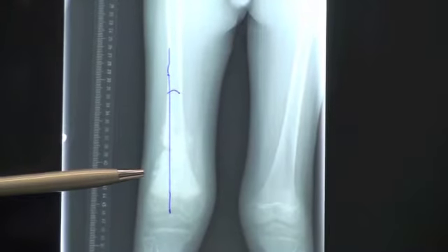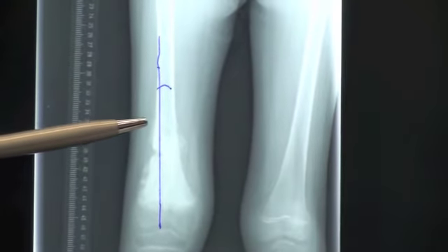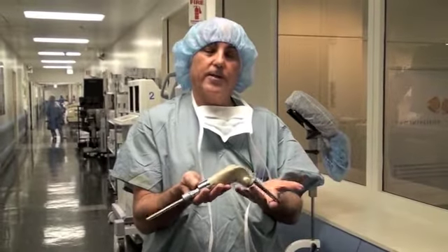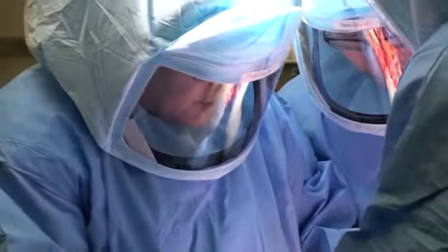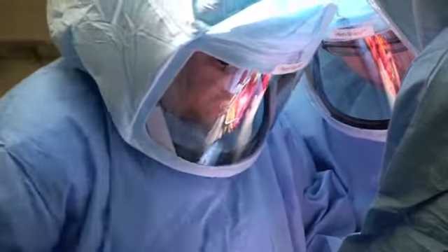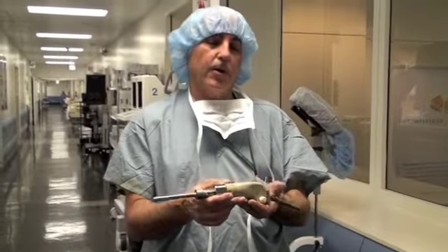The cancer is in the thigh bone — the femur. I'll be removing about 5 inches of his thigh bone, and then I'll put in this device that will replace those 5 inches. It will also give him a bendable knee joint. And finally, this device has the ability to grow, which we'll do 3 to 6 months from now — and that does not require an operation. We can do that without opening up his leg.